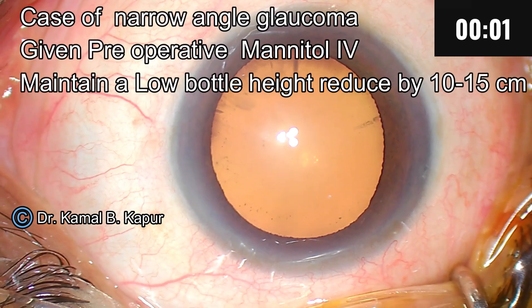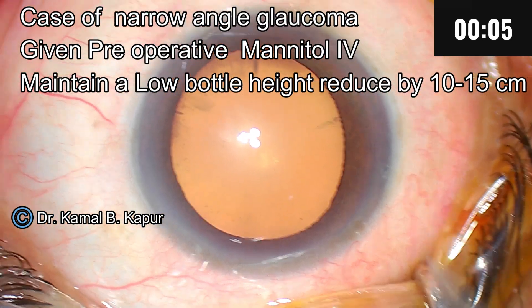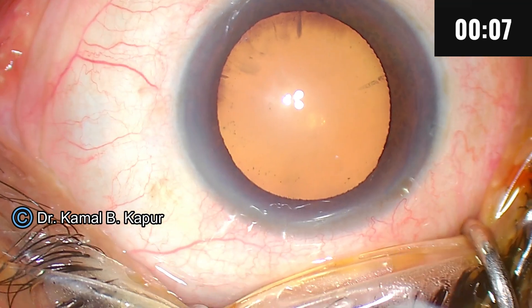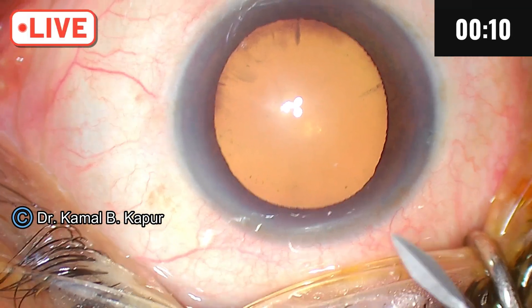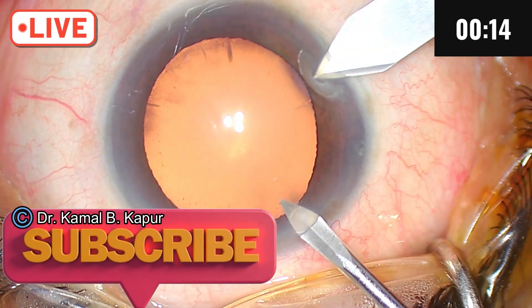The shallow angle with glaucoma — you can see a PI here. We will discuss how to approach a patient with glaucoma. The trick here is to avoid having intraocular pressure rise. The anterior chamber is very shallow.